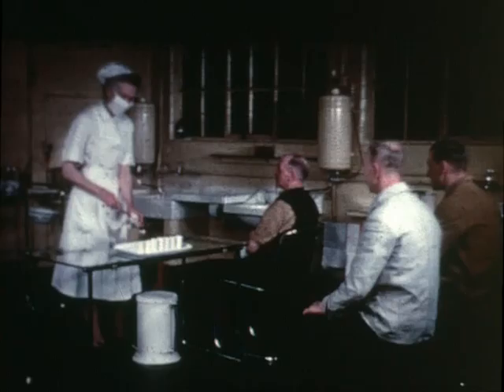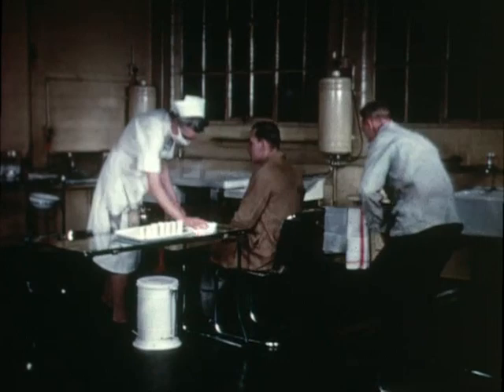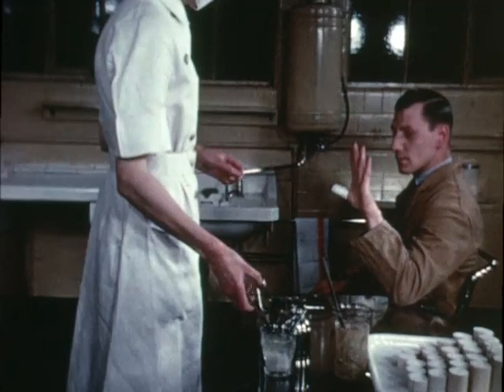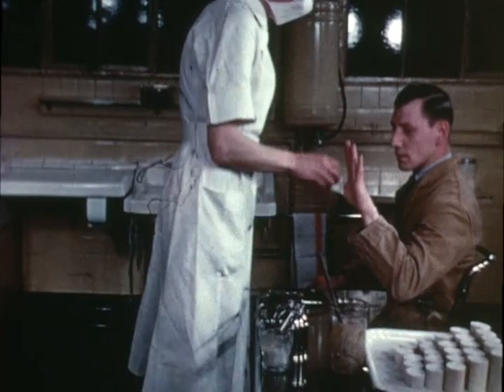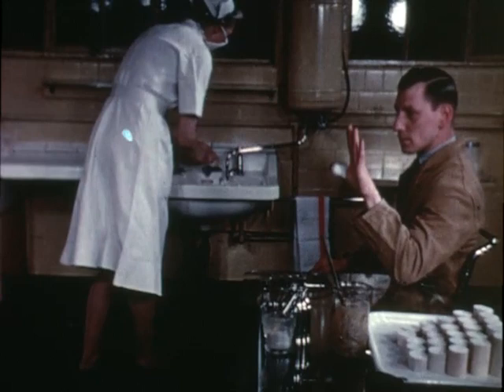The nurse wipes the table with a disinfectant mop to remove any bacteria that may have fallen onto it and then dries it. She then cuts the bandages using scissors kept for this purpose in a jar of disinfectant. She removes all but the inner dressing from the wound and discards the soiled material into a deep bin. Her hands may now be contaminated with bacteria from the bandages, so before getting clean material she washes.